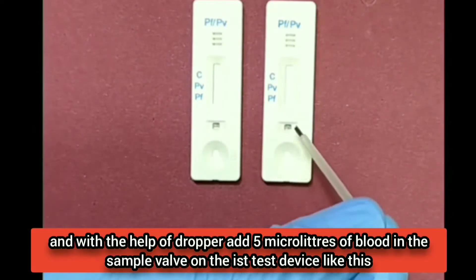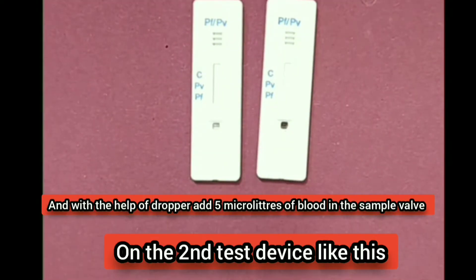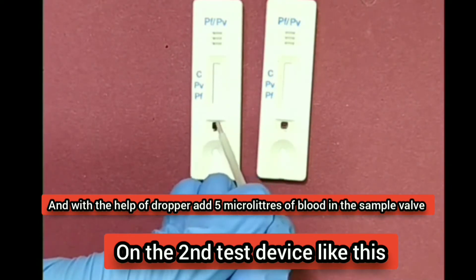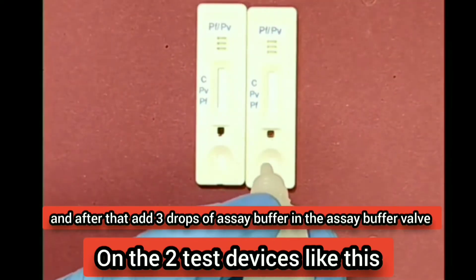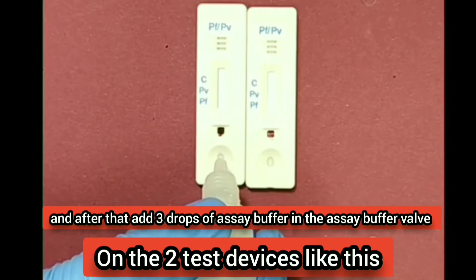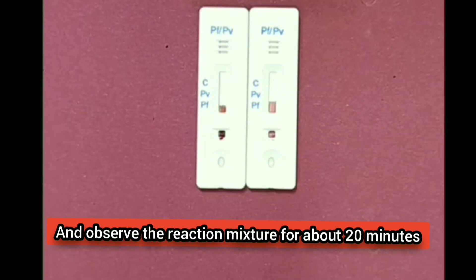Add 5 microliters of blood in the sample well on the first test device. With the help of a dropper, add 5 microliters of blood in the sample well on the second test device as well. After that, add three drops of SA buffer in the SA buffer well on both test devices. Observe the reaction mixture for about 20 minutes.